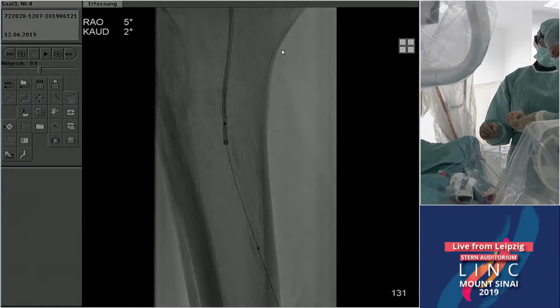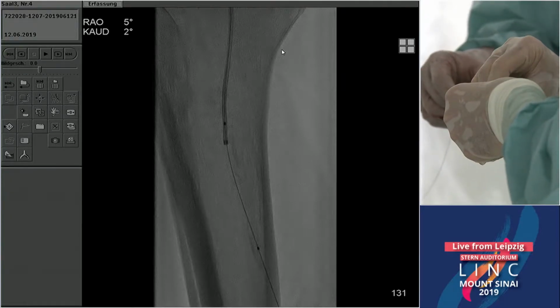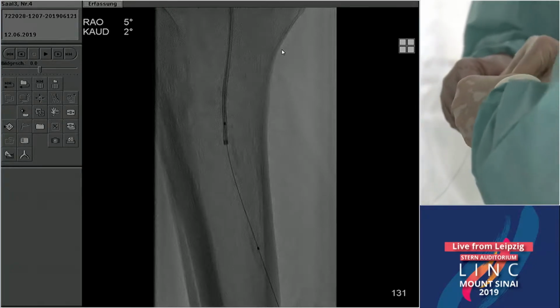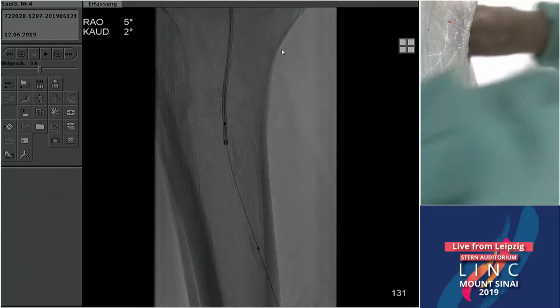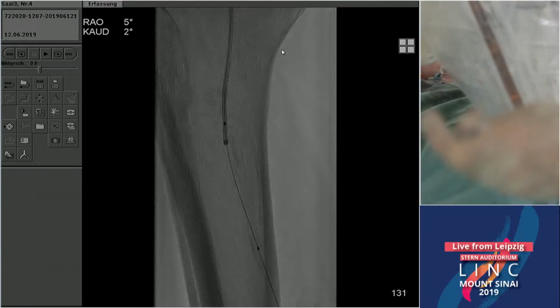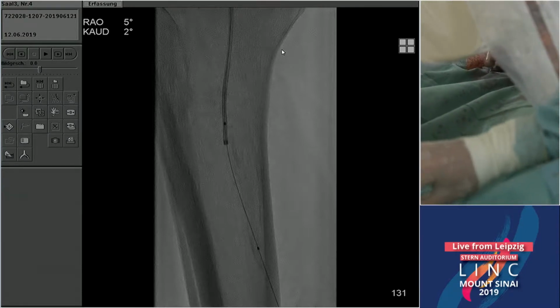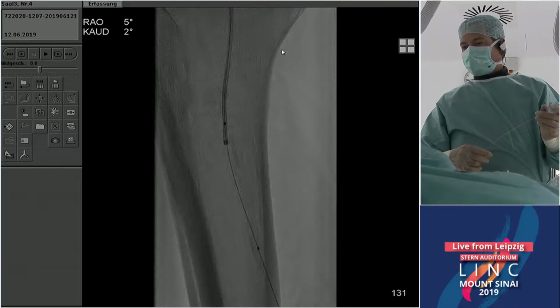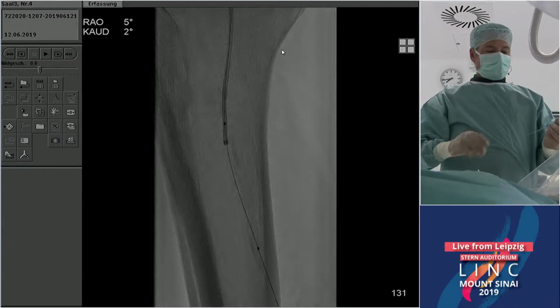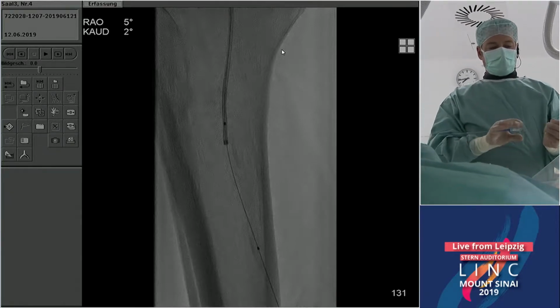I do this for you, Andre. Which wire will you use to integrate? A more supportive 014 wire, Andre? What, now that you put your catheter down, integrate? Yeah, actually, in this kind of lesion, we really do not see any stump. So I'm not sure whether a CTO wire really helps. Otherwise, of course, for difficult lesions, we take CTO wires. But maybe not in this case.